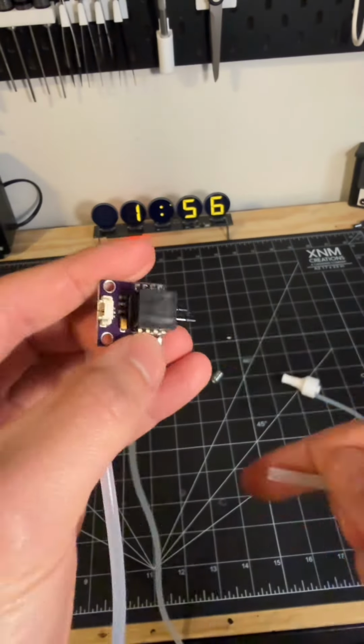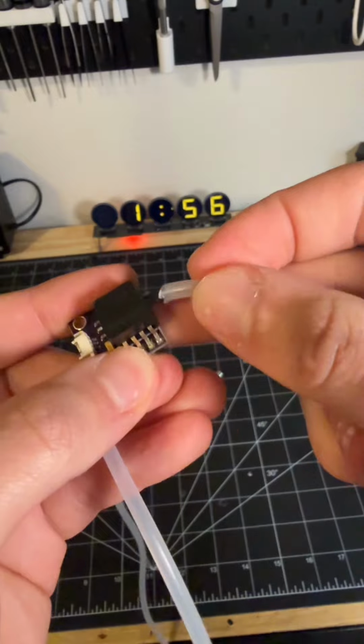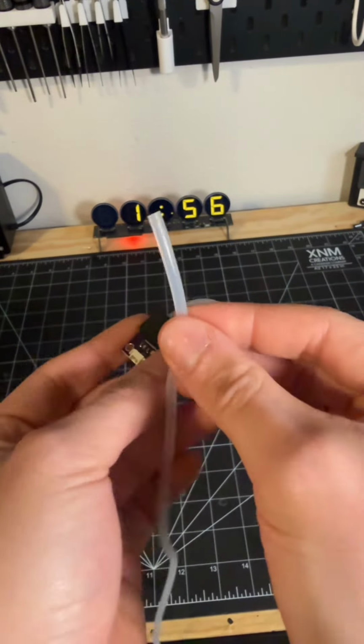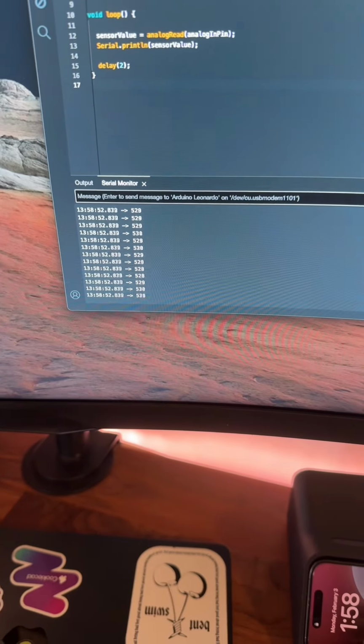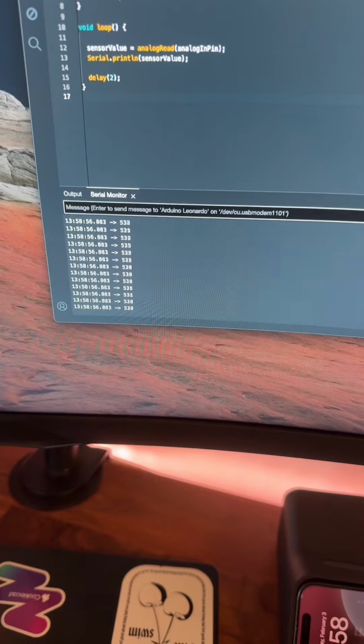Now, this will be the secret sauce of the project, and I hope it'll work. It's a pressure sensor that can detect changes in pressure through these little nozzles. I'm gonna hook this tube up to it, which I should be able to blow and suck into and read that difference. Got it hooked up to the computer. You can see it's reading the data. I'm gonna blow in the tube. Nice, you see it change, suck on the tube.